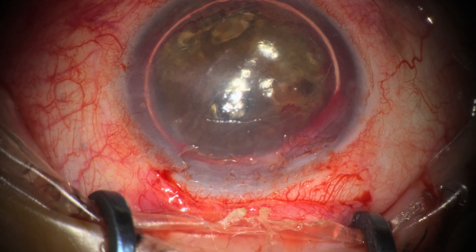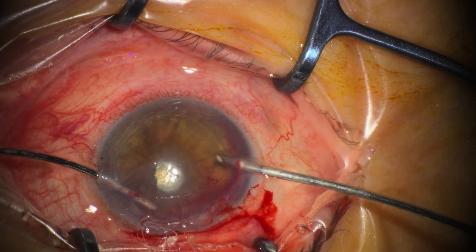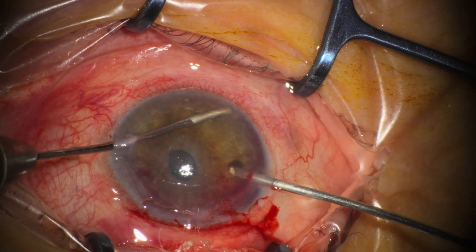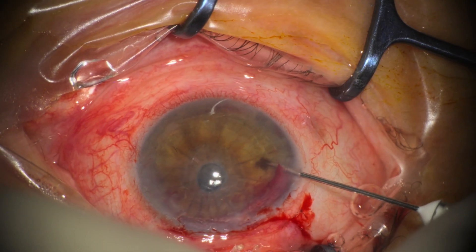We've used handheld diathermy, and then using irrigation-aspiration we're aspirating the blood from the anterior chamber. We then inject Avastin into the anterior chamber — and that concludes the surgery.